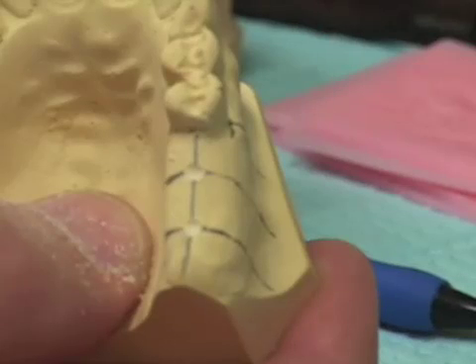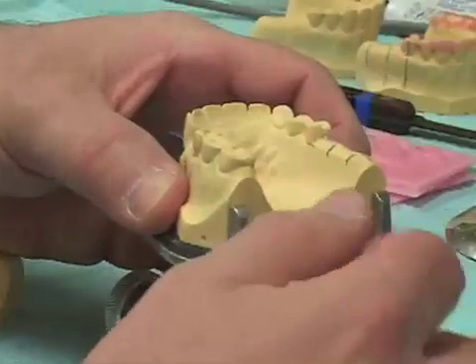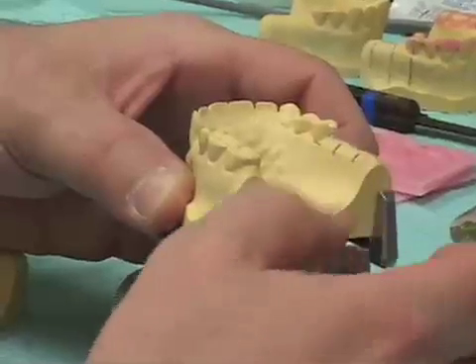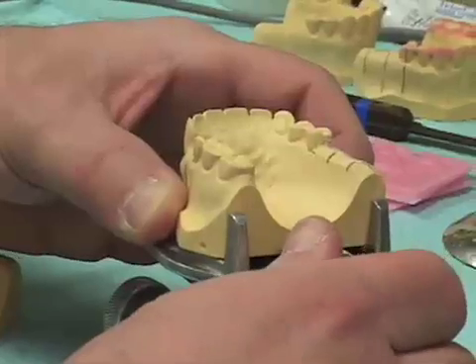The next thing we need to do is to determine the orientation or angulation that the implants will be placed. By placing the cast in the dental surveyor table and securing it, we will place our cast on a dental surveyor and determine the orientation for our implants.